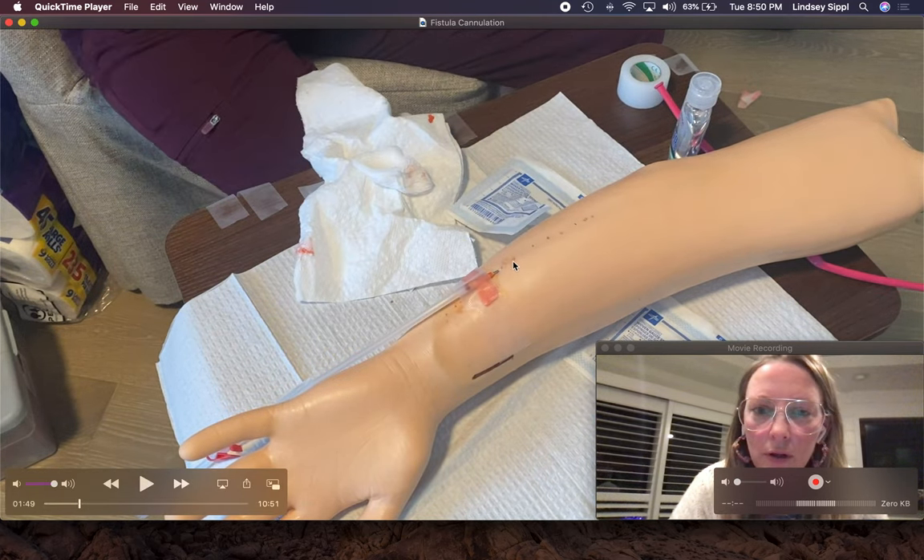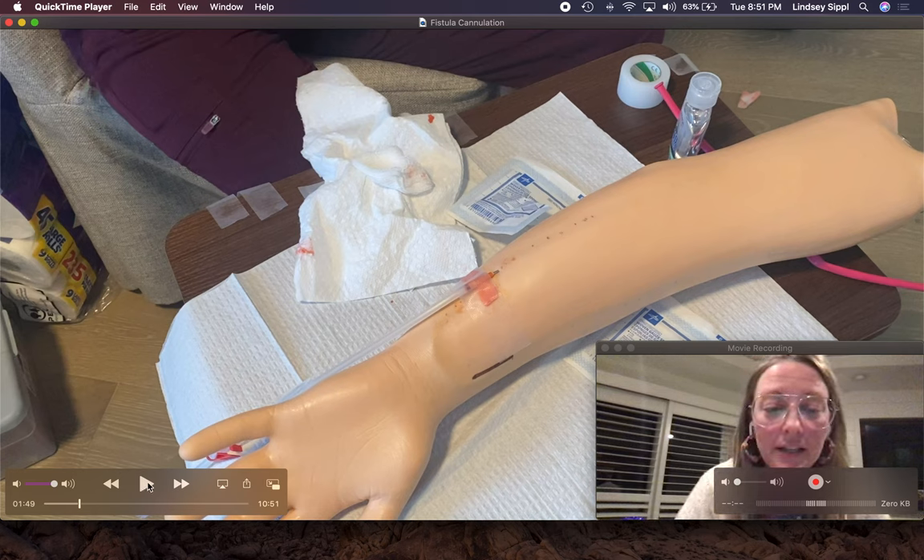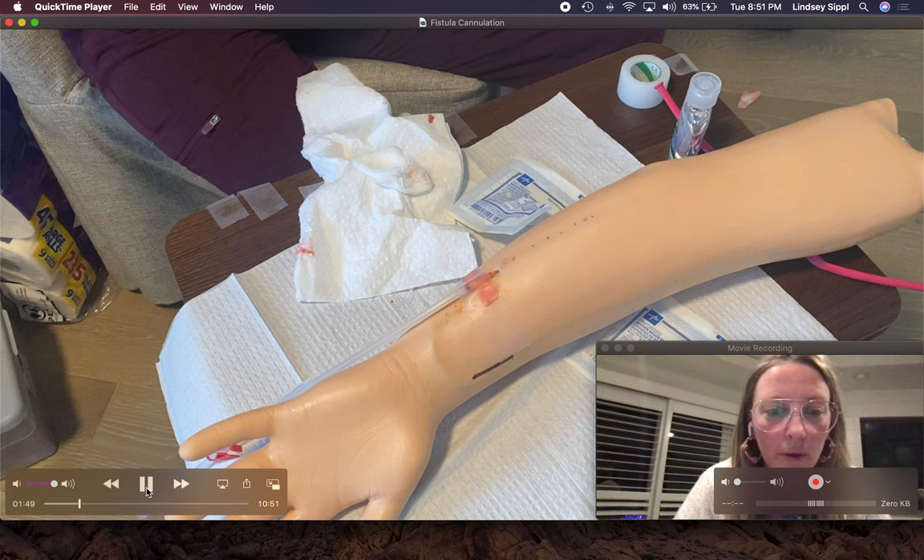Some people will clean the arterial site and then the venous site right away. I've been trying to get away from that, because whenever I cannulate I end up putting a hand up near where my venous needle is going to go. So I should be cleaning that again if my hands are all over where I want to cannulate.